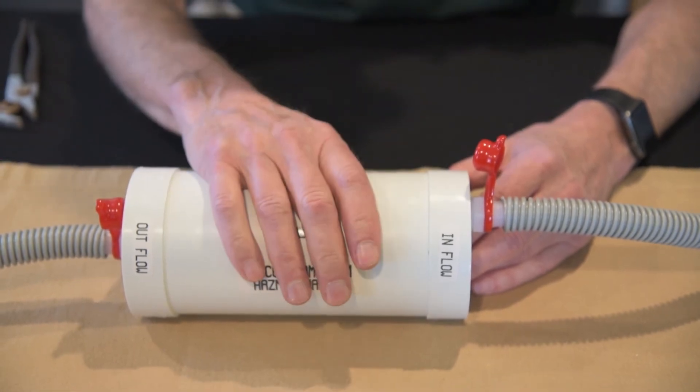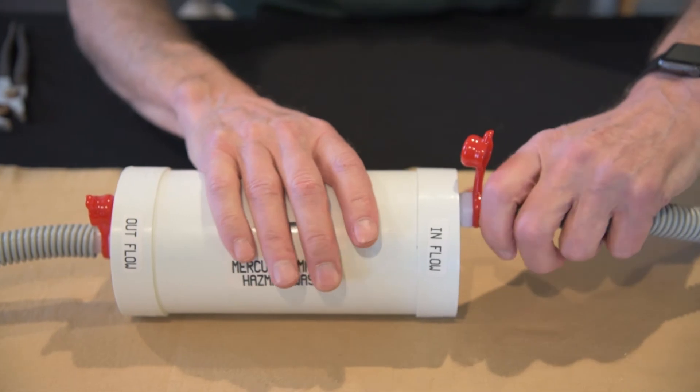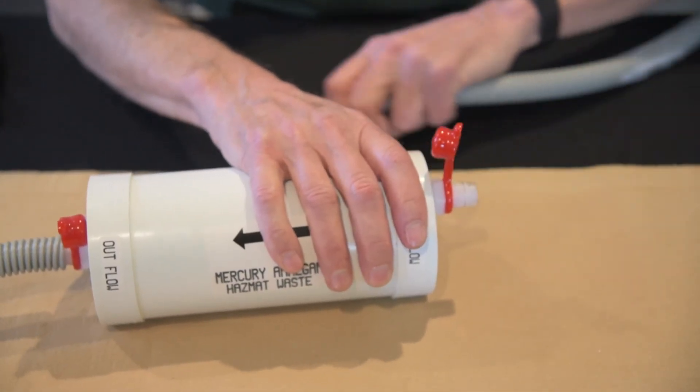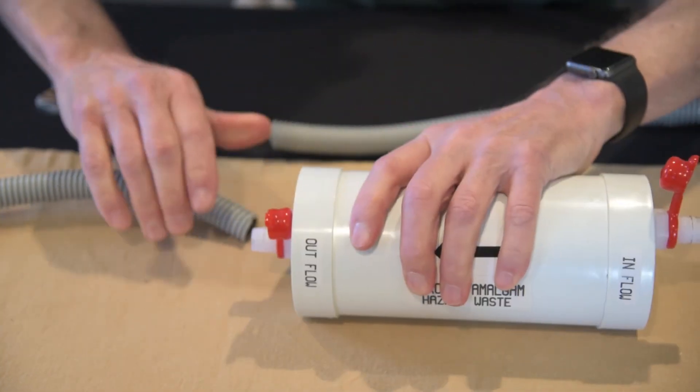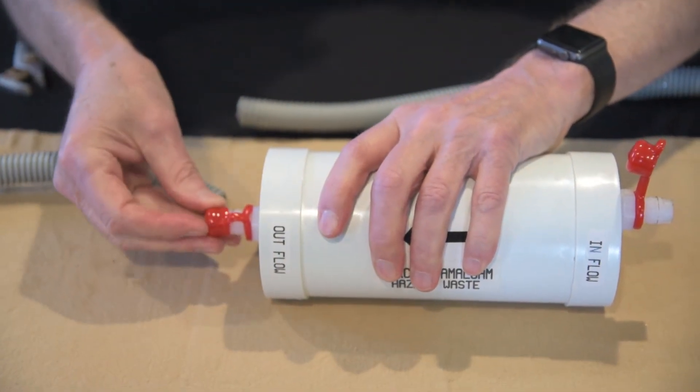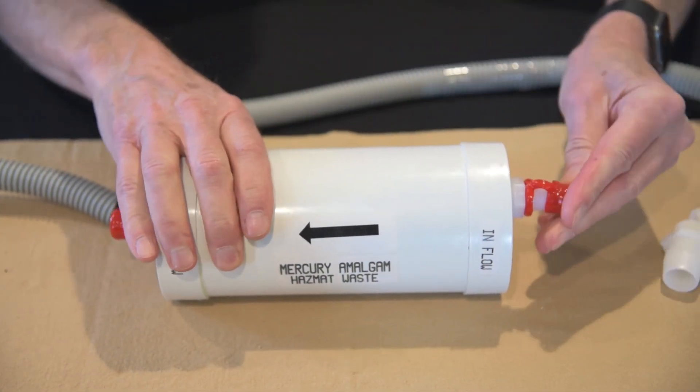And to replace the filter, you just do the opposite of what we've just done. Let's slide the tubing off the two ends. Now we're just going to put our caps on these, just going to put the caps on the end of these two things.